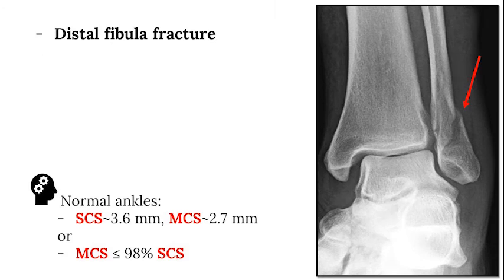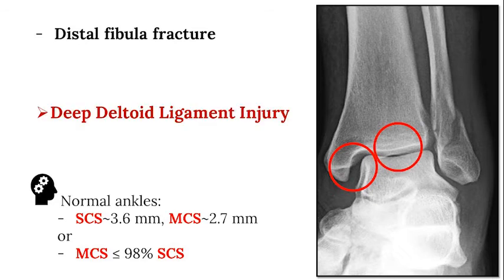This x-ray demonstrates a fracture of the distal fibula. However, examining the medial clear space, it is wider than the superior clear space, suggestive of a deep deltoid ligament injury.